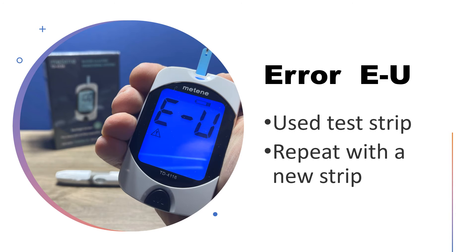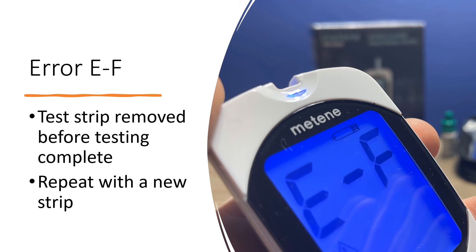Error EU: EU means that you've used a previously used test strip. Simply repeat the test using a new test strip. Error EF: EF means the test strip was removed before the test was complete.